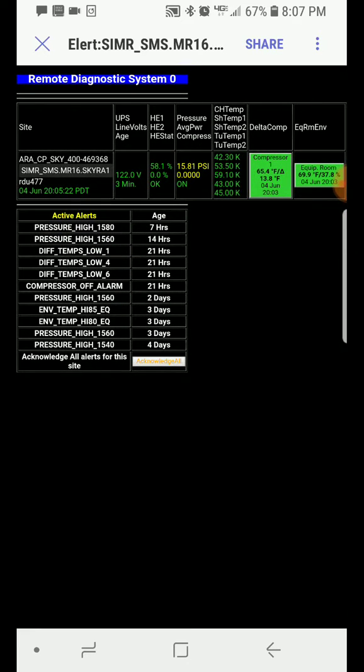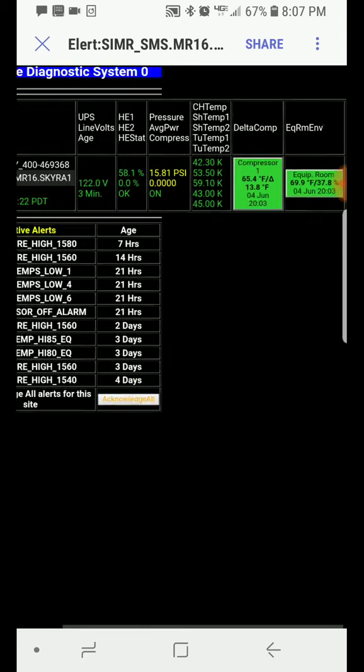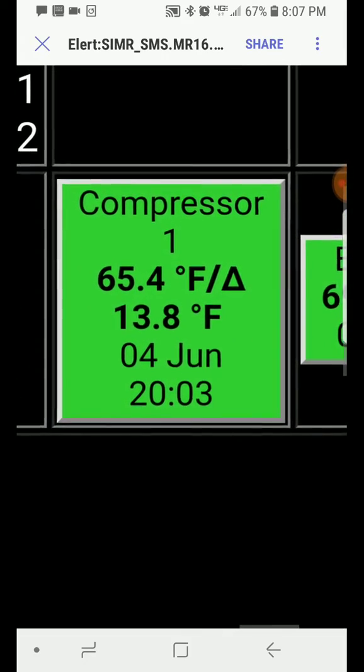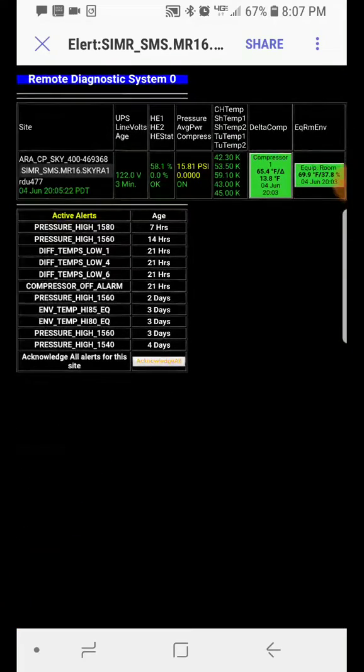If you're not familiar, you should be familiar with the green board in each of these cells before watching this video. So the differential alert is telling you what's going on with the compressor 1 button here, which we're going to press. So let's press it.